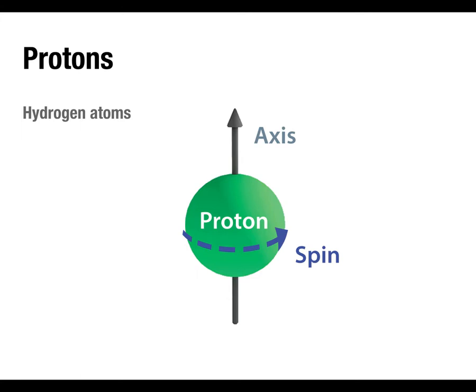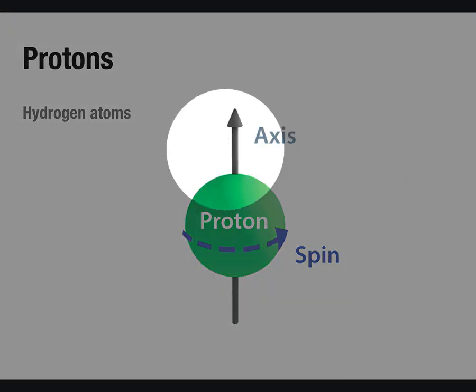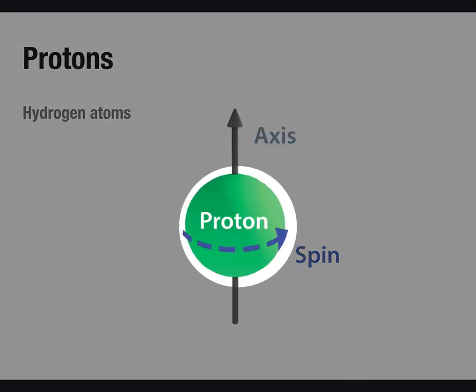There you can have even much higher field strengths, and you can actually tune them to different atoms and not just hydrogen. But in human imaging, we focus exclusively on hydrogen, mostly because it would be a lot more expensive to build the MRI scanners around multiple different atoms, and because water is such a ubiquitous element in the human body. So when we look at a hydrogen atom, which we also call a proton.